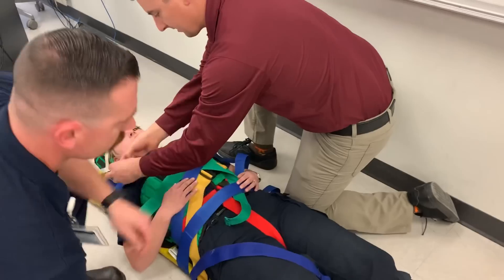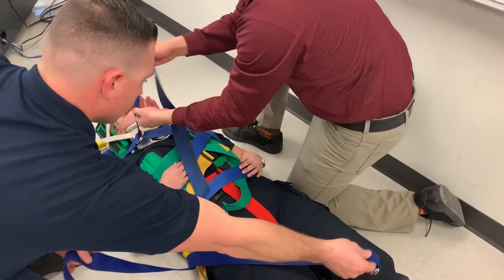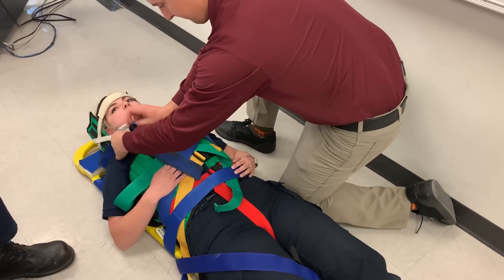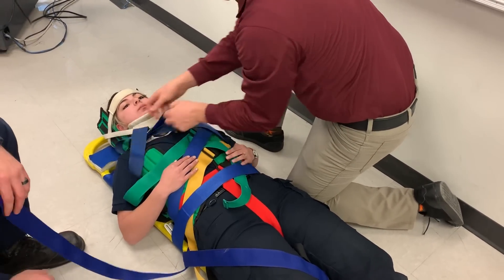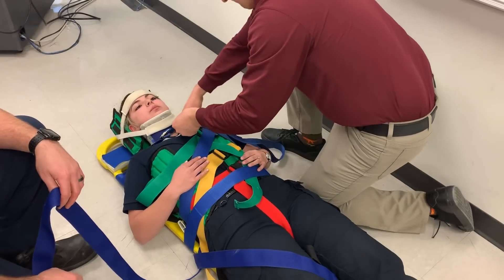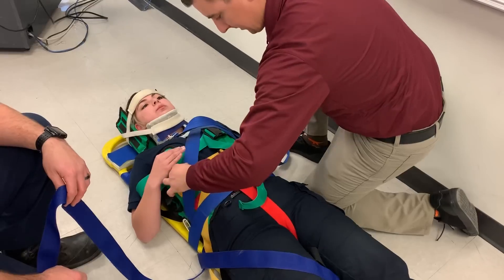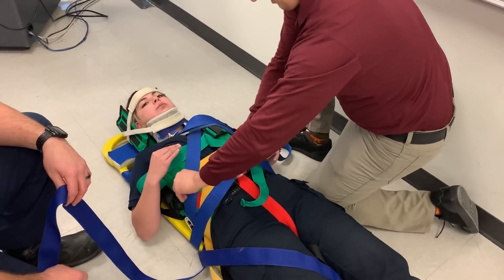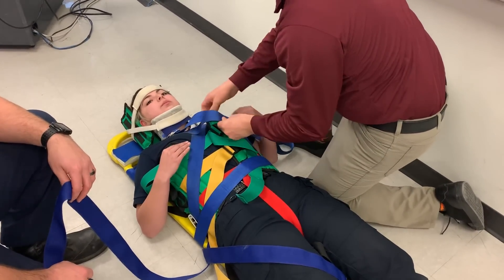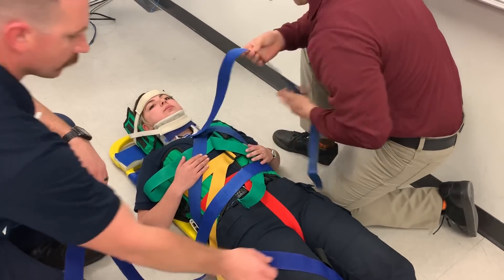Make sure the D-ring is not on the center of the chest. Get all slack out, feeding and pulling, and take a deep breath for me. Okay, now you can relax.